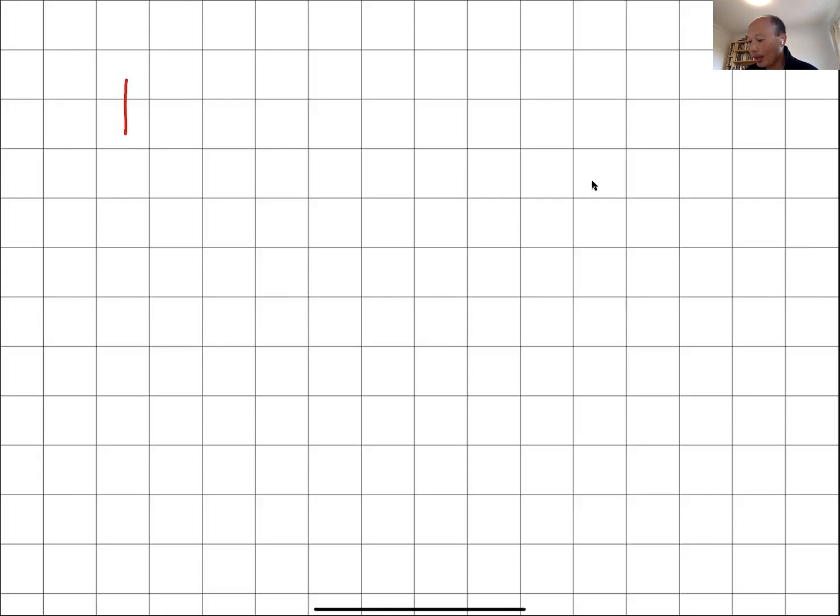So we imagine we have some M0 equilibrium magnetization, and that's typically in line with the B0 field. The first thing we can think about is we typically have these coordinates Z, X, and Y. And by definition, we imagine the M0 is aligned with the Z coordinate.